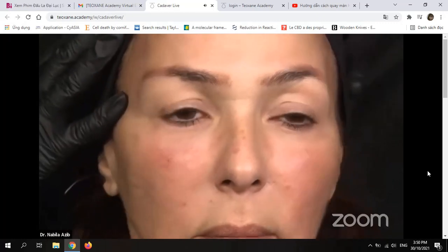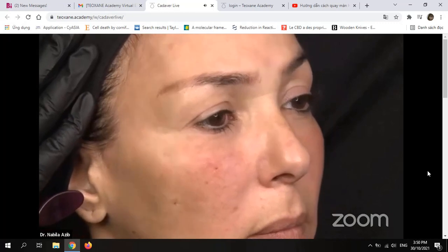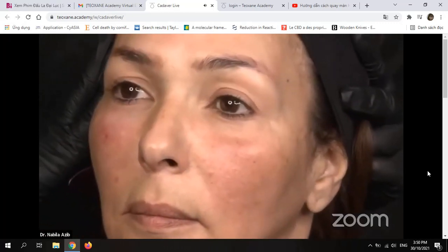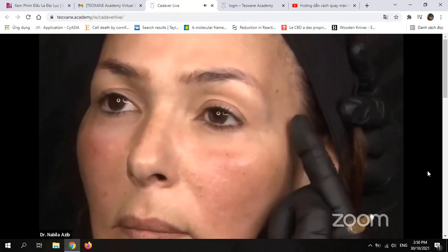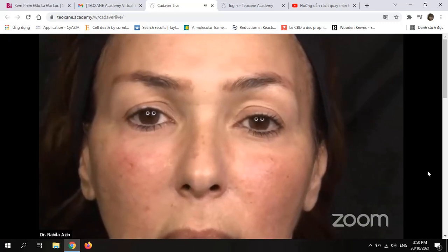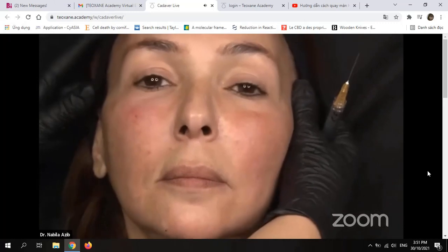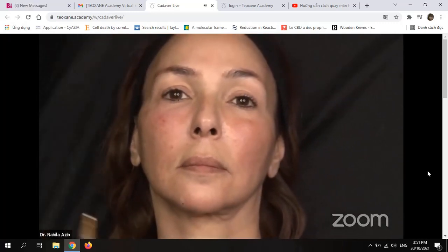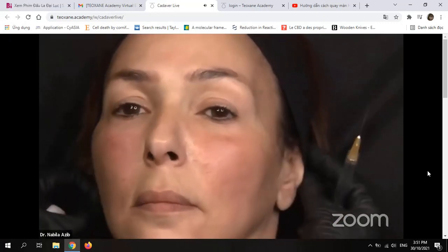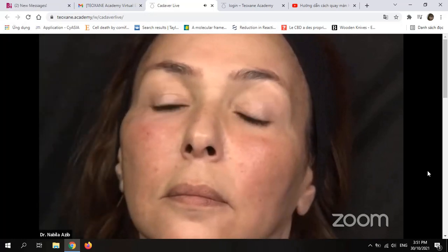Really a very fresh look of the patient after this procedure. I don't want my patient to have a tired, looking-down result, so I just want to refresh this area of shadowing, like here, and restore the volume that she had before. I know her for several years, so I know exactly where the volume was when she was younger. So I'm just refreshing and restoring the volume.